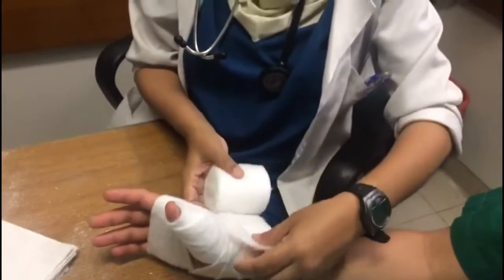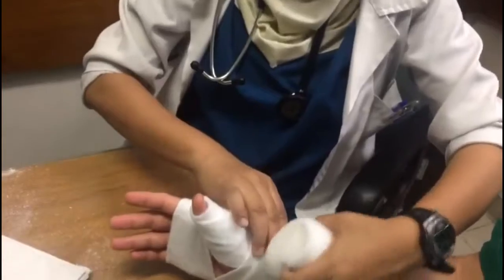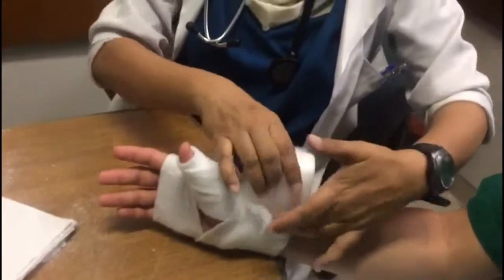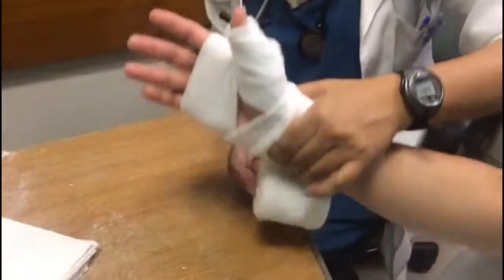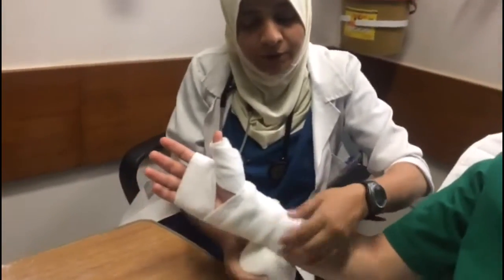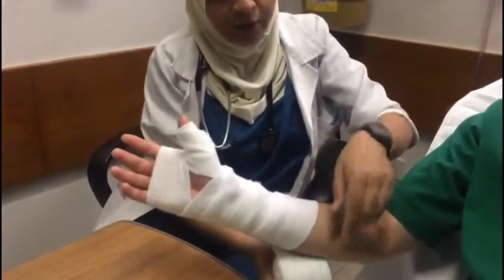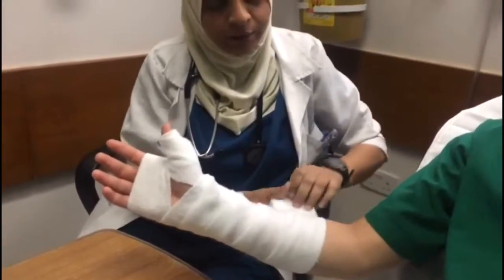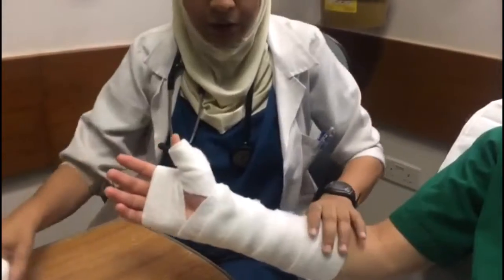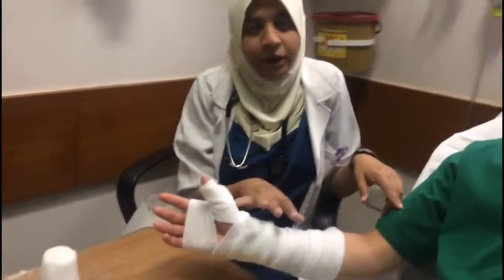The wrist piece runs along the extensor aspect of the hand and forearm, beginning at the metacarpal heads and ending just short of the antecubital crease. We go up to the mid forearm, and for the long thumb spica, up to the elbow — but for most uncomplicated injuries, mid forearm is fine. Ask the patient to envision holding a can of soda.